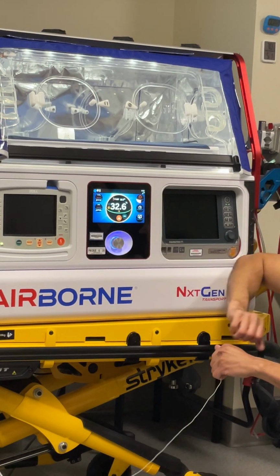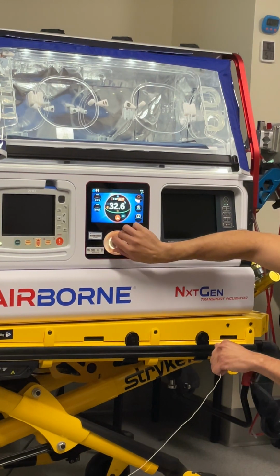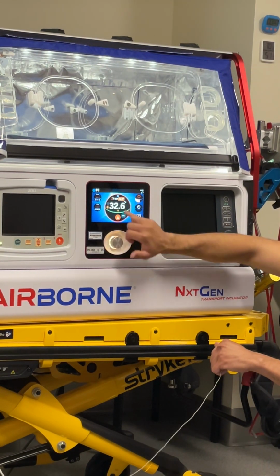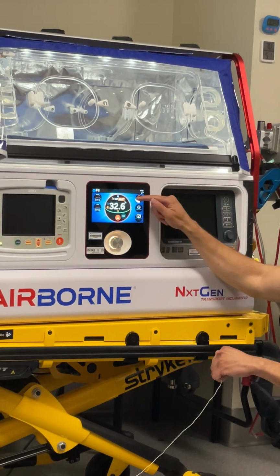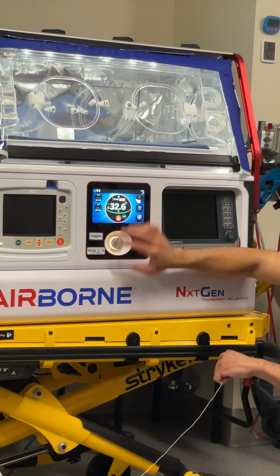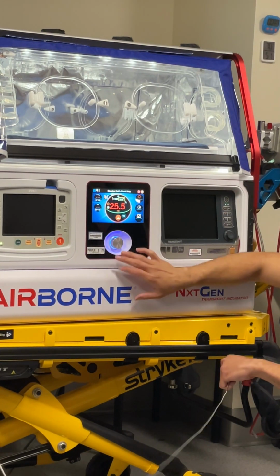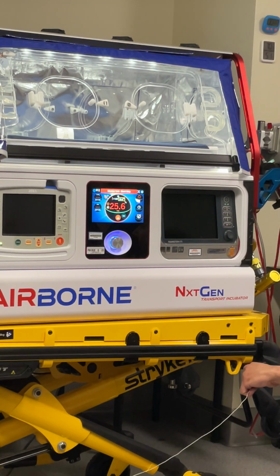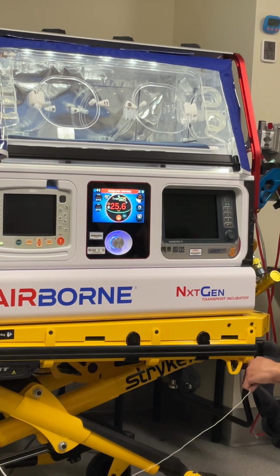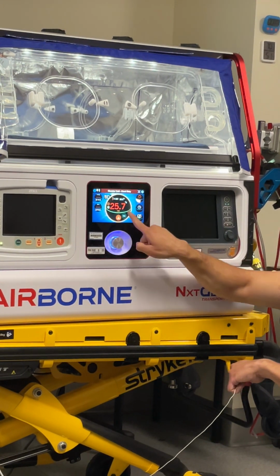The air temp is still displaying on the top. Actually, it doesn't show air at that point. It's our setting and then what's on the patient. Okay, so then we can go back to air. Wait, so when it's in baby mode, it's not telling you what the air temp is. It's telling you what the skin temp is and what you have it set to. Yep. So it doesn't give you notice for that.